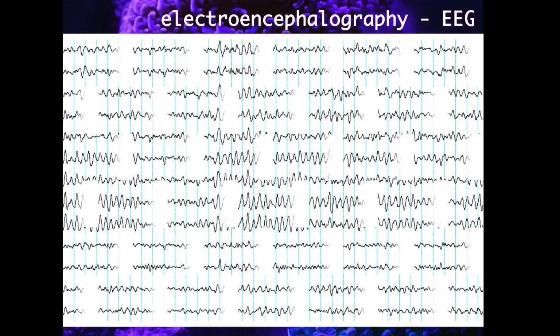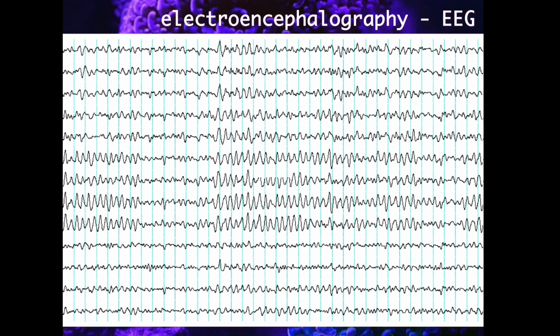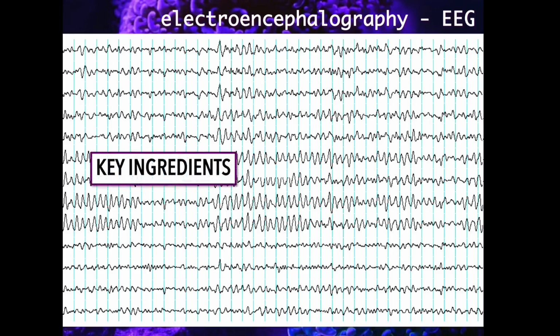Electroencephalography, or EEG, is a neuroimaging technique widely used in research that has provided key insights into human brain function and its relationship with cognition. This extensive success has a few key ingredients. First, it is a non-invasive tool. EEG provides indexes of brain activity without producing damage, and this means that we can use it to study human cognition in different populations.